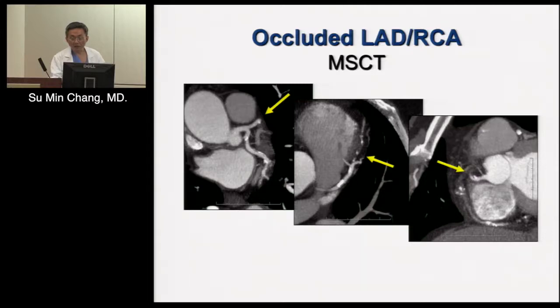But in your clinical practice, if you see a mid-LAD 90% lesion, you cannot interpret OM and RCA, well, I don't think it matters too much. You take the patient to the cath lab, you do the angiogram, and if you have 3-vessel disease, then you bypass, depending on whether they have diabetes or not. Otherwise, you do the PCI. So that's the key.